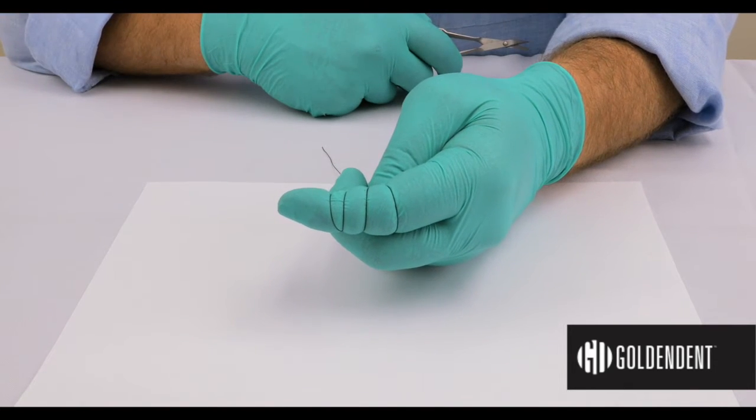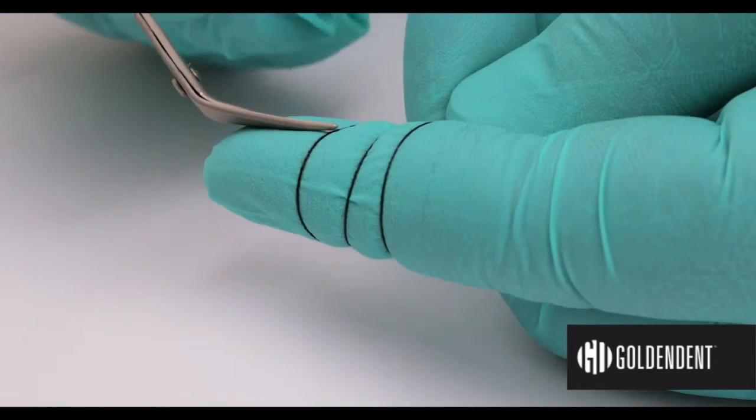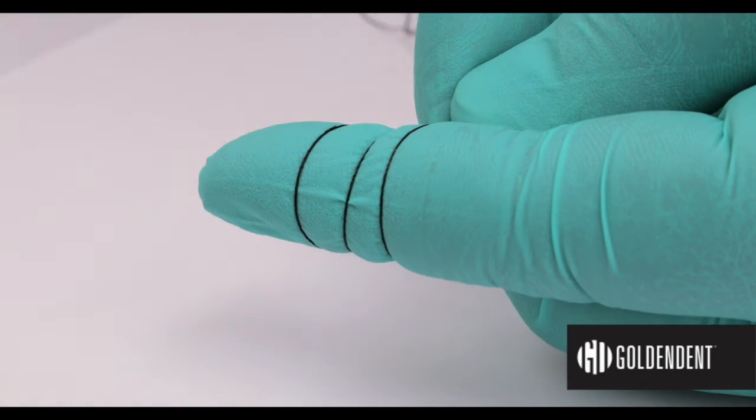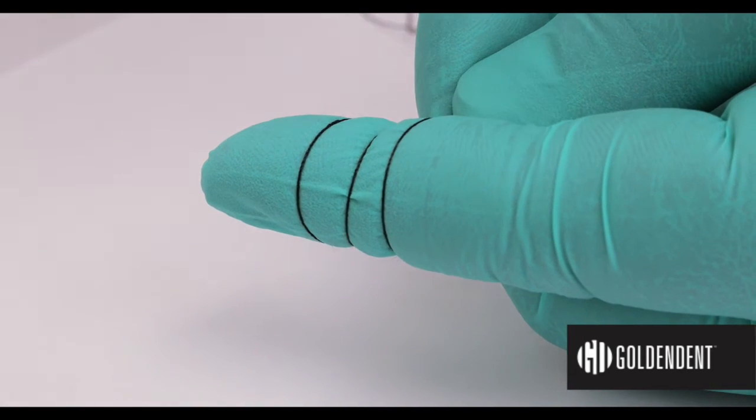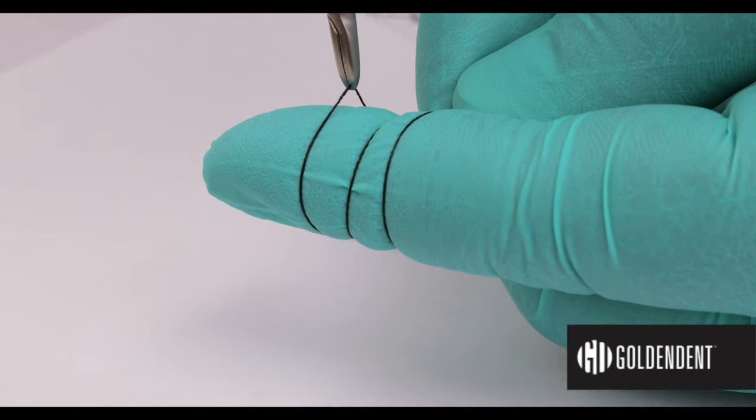The traditional means of removing a suture is to either sneak a pair of scissors underneath or to use a forceps to lift and create some space so that a pair of scissors can be fit to cut the suture.